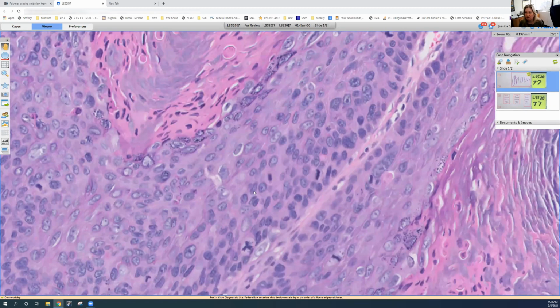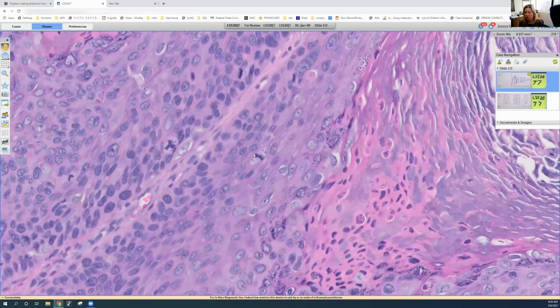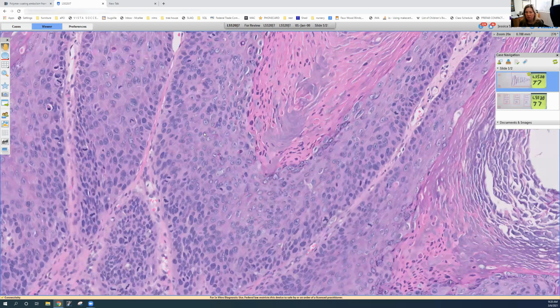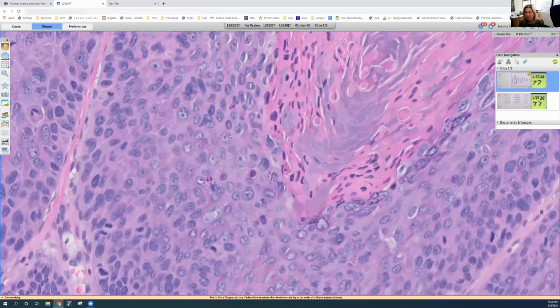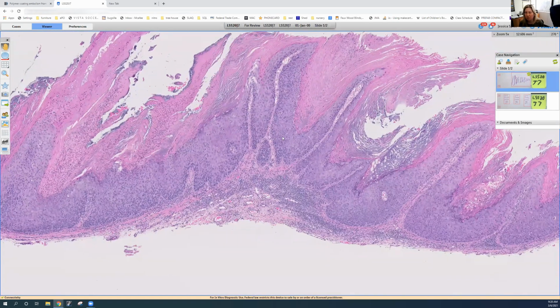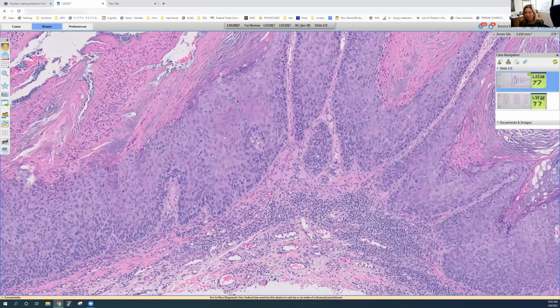This is full thickness squamous atypia. You can see this is a tripolar mitotic figure, and there should not be mitotic figures above the basal layer. Also important to the diagnosis are these individually apoptotic keratinocytes. This is squamous cell carcinoma in situ, but this is on the genitalia. So this is an HPV-induced squamous cell carcinoma in situ, or Bowenoid papulosis.